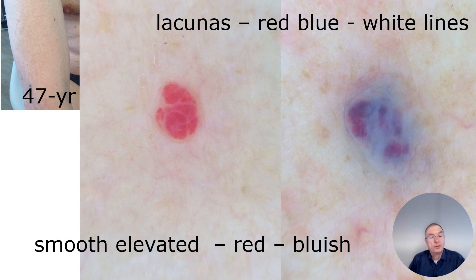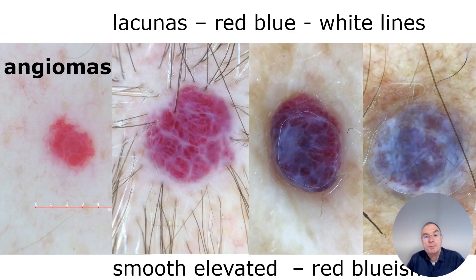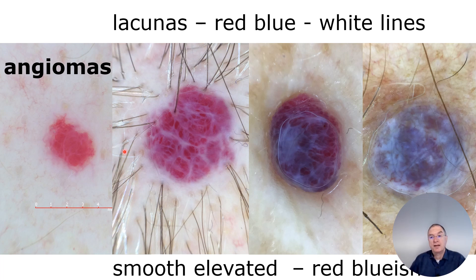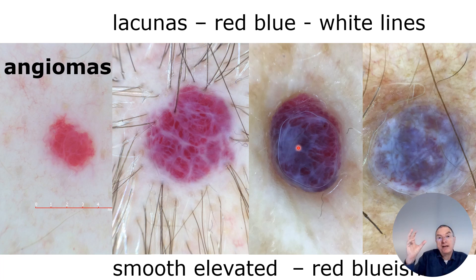Typical lacunas — we call these lacunas of bigger globules in angioma. Angiomas can be presented in different sizes and different colors. Very early ones are just underneath the basal membrane and a little bit cherry-like. You see much more white light, which is typical and can be seen in angiomas, but only in polarization light. Some are more cherry and more elevated, or also a little bit cherry but more located in the dermis.